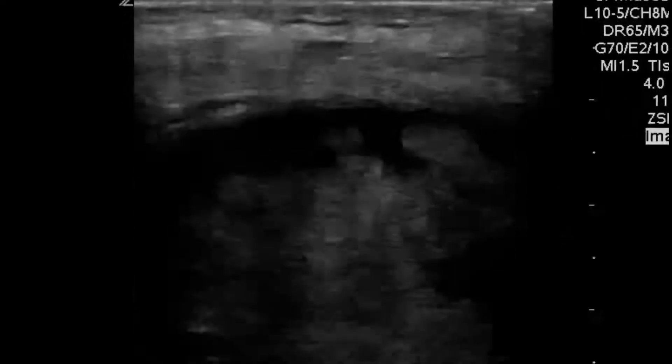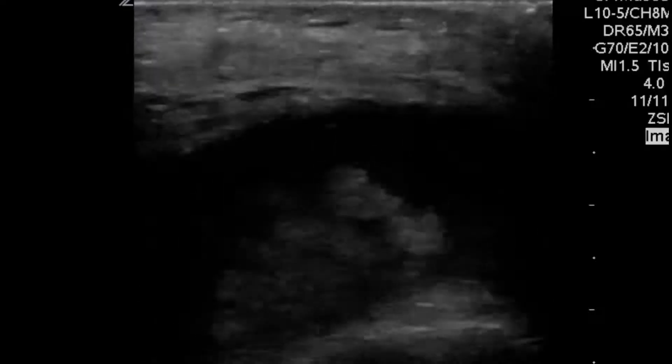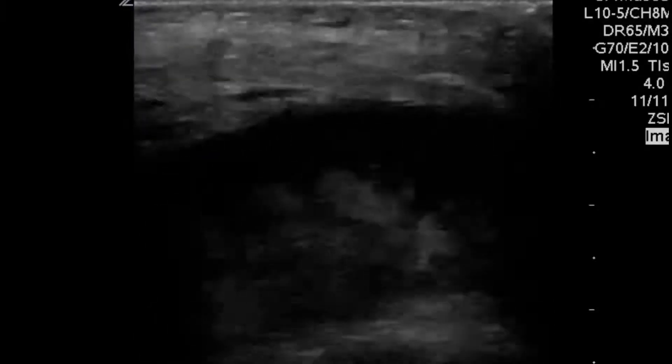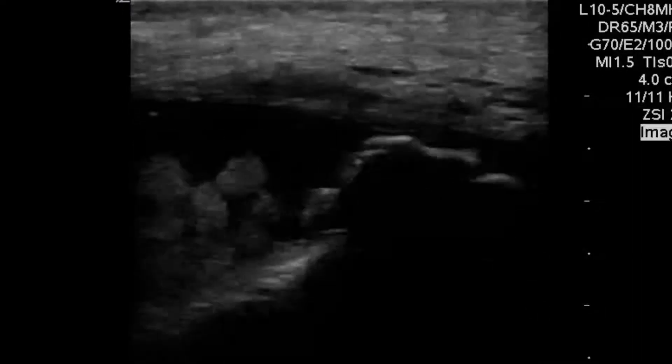We needed to reach out to our MSK ultrasound specialist guru, Dr. Jeremiah Ray. And luckily, he was able to tell us that this is consistent with synovitis and huge synovial hypertrophy.